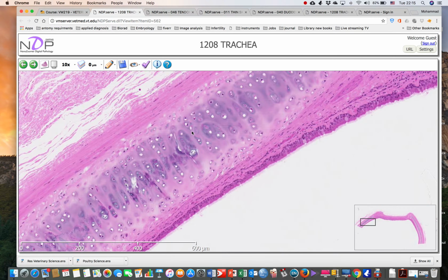As we can see here, we can see the cells without any fibers. As we said, the refractive index of the fibers and the ground matrix are similar, so we could not differentiate between fibers and matrix. So the only thing we can see is the matrix.